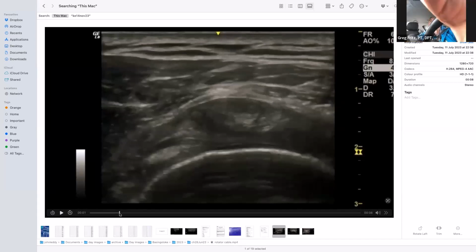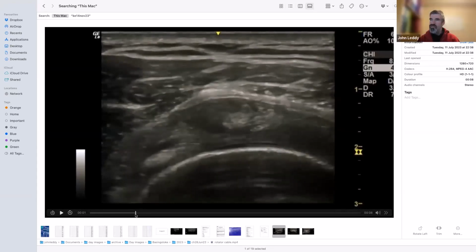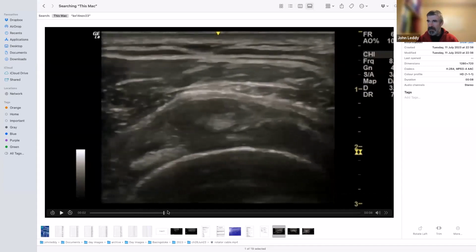So is it above that where we have the coracohumeral ligament? This is a little bit proximal to where you'd normally be looking for that. Okay, I am not an expert in that at all. I normally think of if we will see that as we come through.